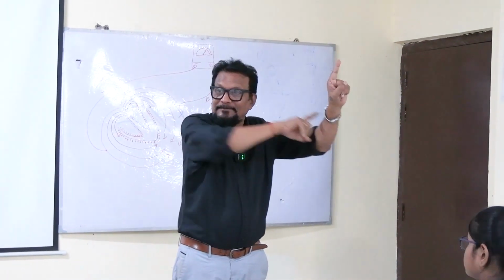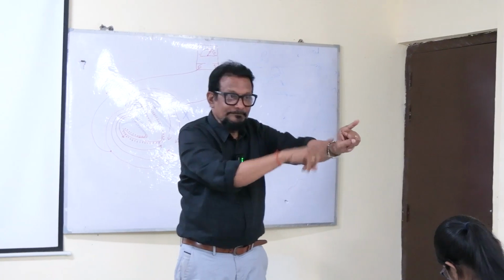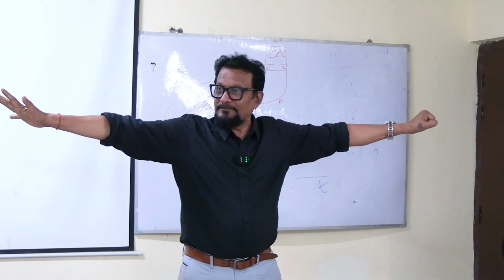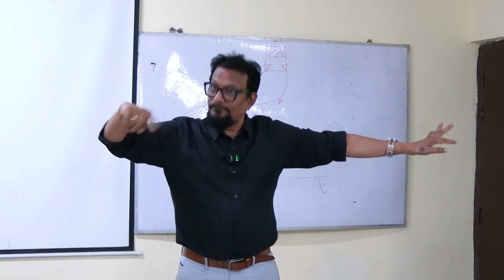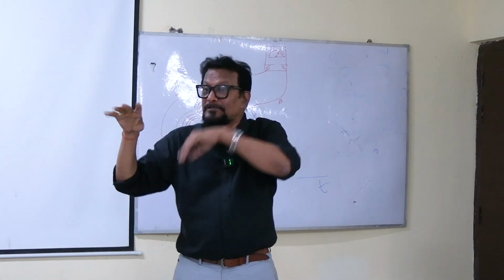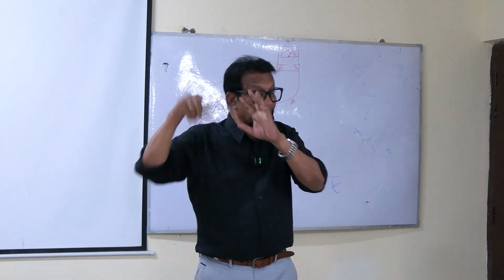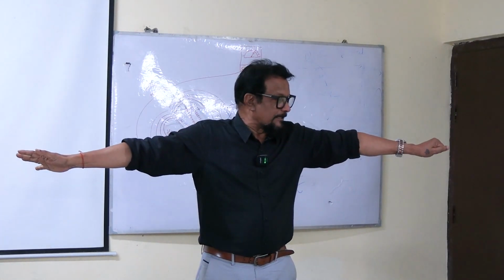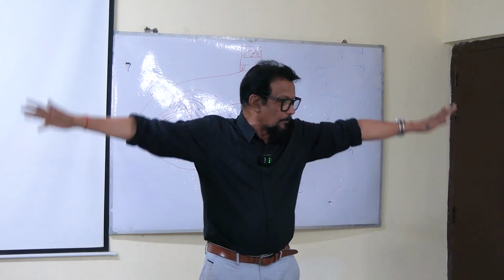Connecting this and that, where should the positive pole be? Here, the left hand. So in lead 1, this is positive. So definitely there will be a positive wave. And it may vary. When the current flows in the opposite direction, it may produce a negative wave. It will depend. So P, Q, R, some are positive, some are negative. We will find that. So where is the positive pole? Left hand. Negative pole, and this is lead 1.